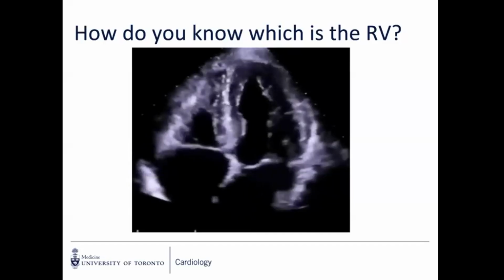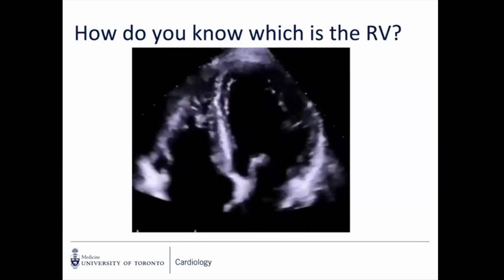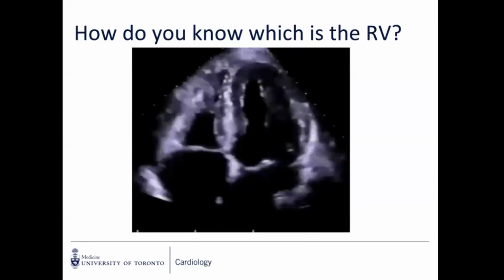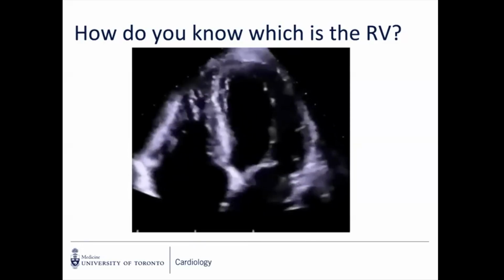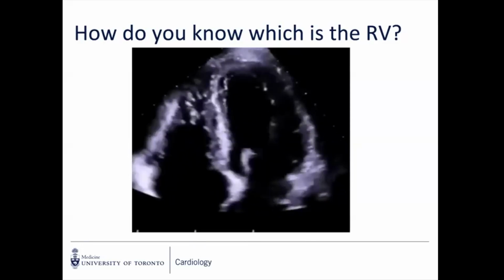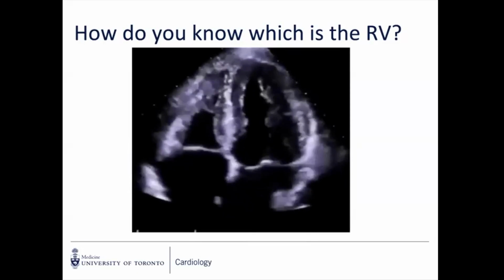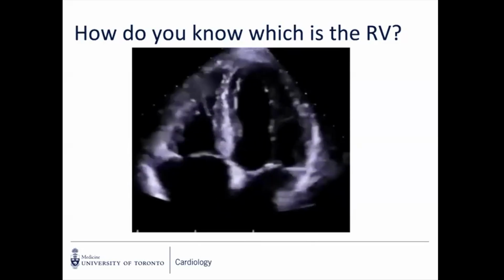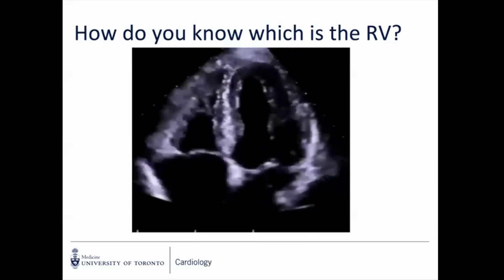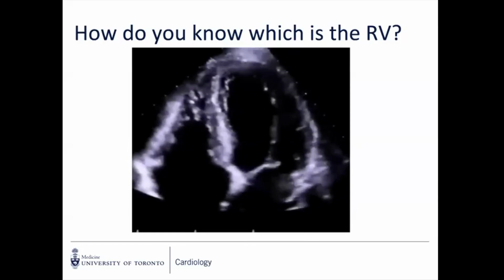Size. Tricuspid valve. So the positioning of the tricuspid valve will always sort of be above the mitral valve. In this view, you can't see it, but also there's the presence of a moderator band. In your outflow views, you may be able to see that crista, where there's this difference between the smooth part of the heart and the muscular part of the heart. The trabeculae, depending on the patient, may be helpful.